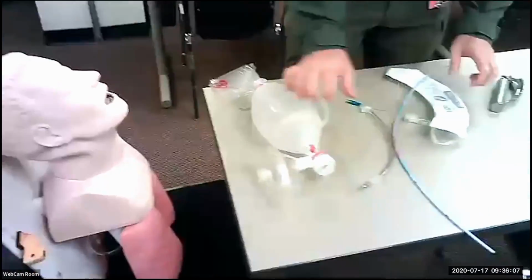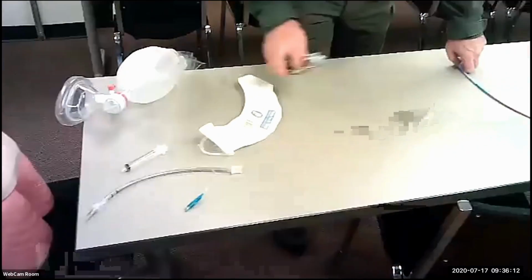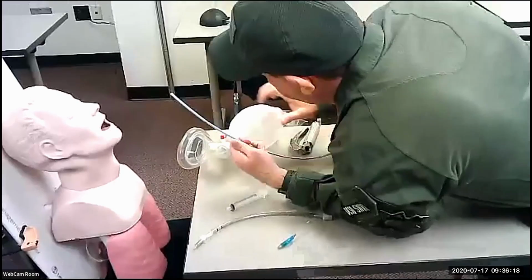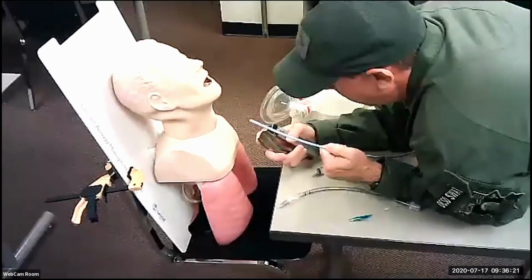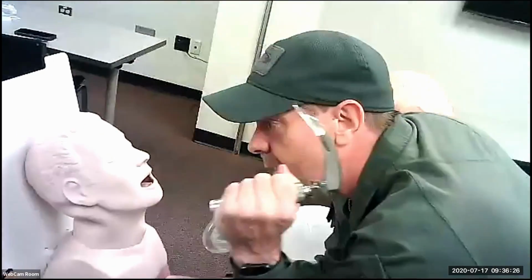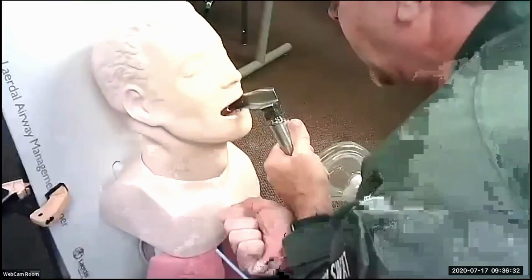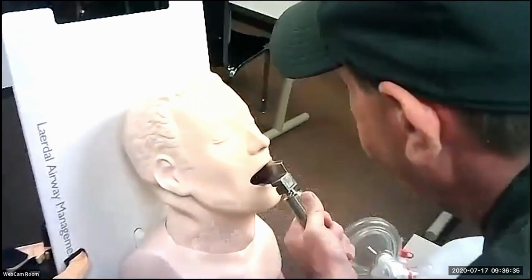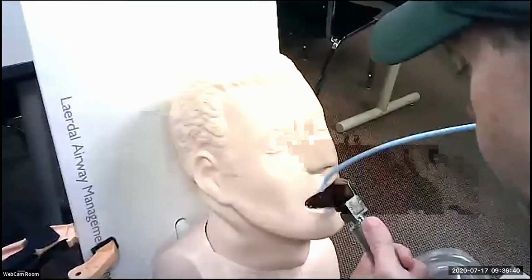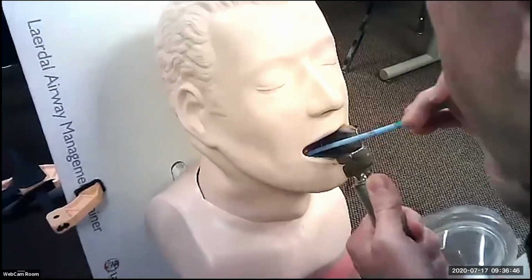All right, so I'm going to get all my equipment ready. Get on the hood of the car. All right, so tomahawk intubation. The reason why we call it that is because we're holding this like a tomahawk. Okay, so what I'm going to do is I'm going to get down in here, and I'm looking for the same thing you saw on the video. I'm looking for the vocal cords. All right, I'm getting in, pulling back the epiglottis, sliding this down.